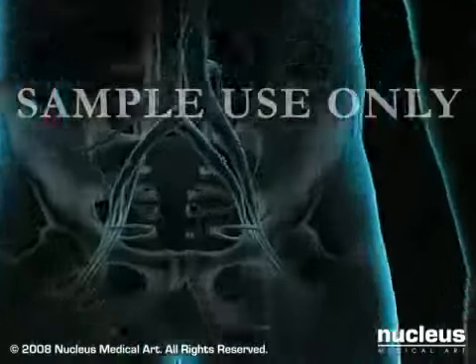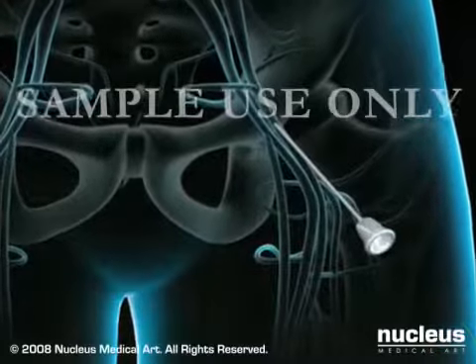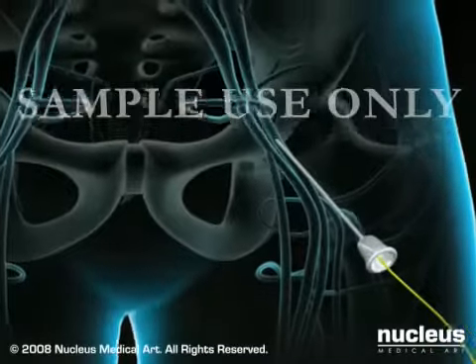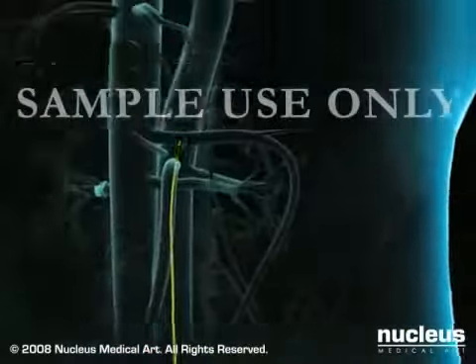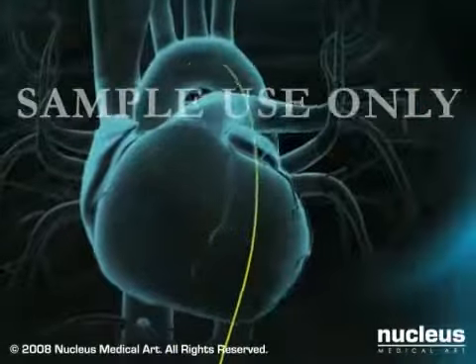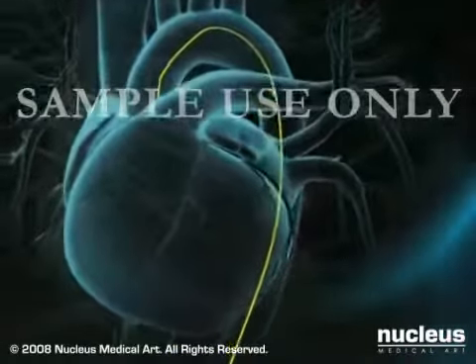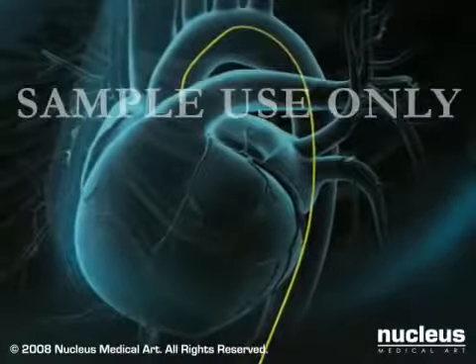The doctor numbs the skin in your groin area and inserts a needle into your femoral artery. Once the needle is placed, a guide wire is passed through the needle and gently guided through the arterial system to the heart. The needle will be withdrawn and exchanged for a small, flexible tube called a sheath, permitting access to your femoral artery. At this point, you will be given a blood thinner to reduce the risk of blood clots.